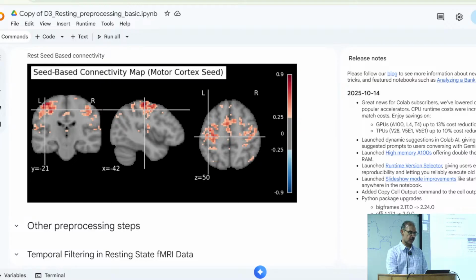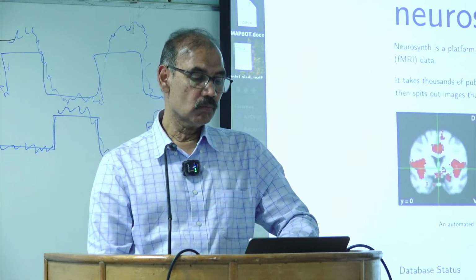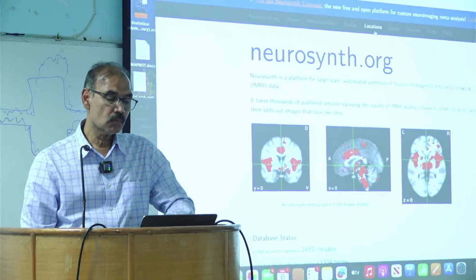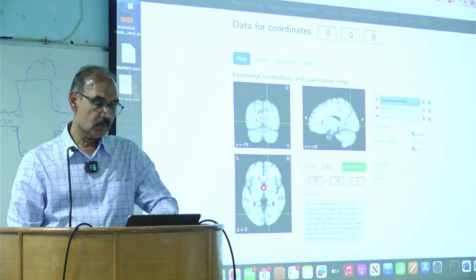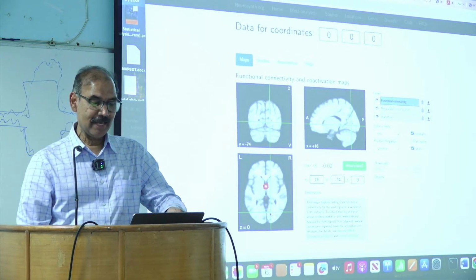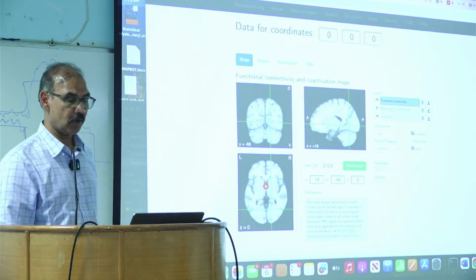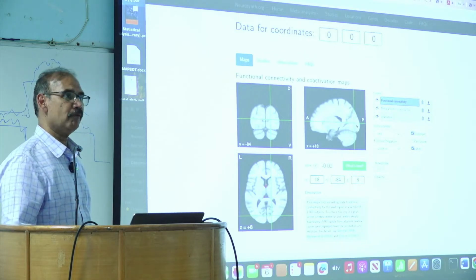There is a website called Neurosynth. We have someone with a medical background, right? Just help me identify, if I had to locate the visual cortex, where would it be?